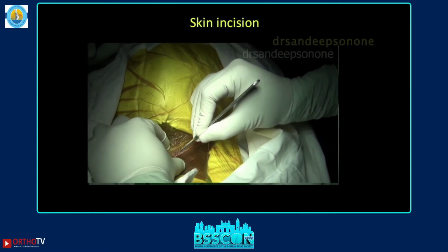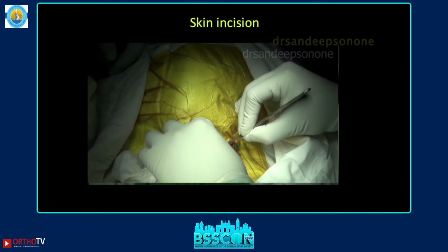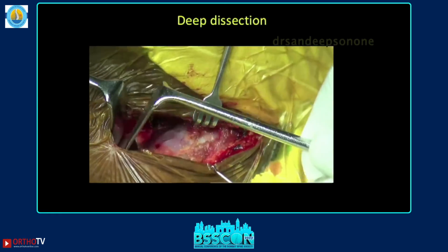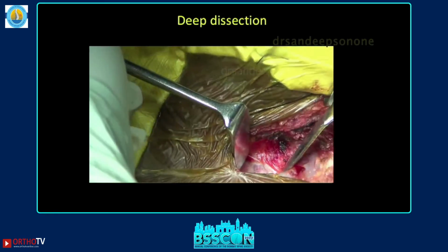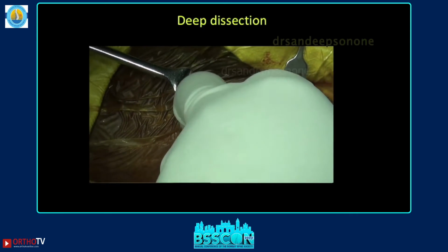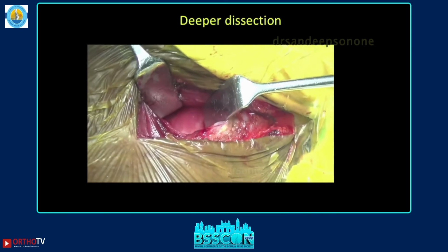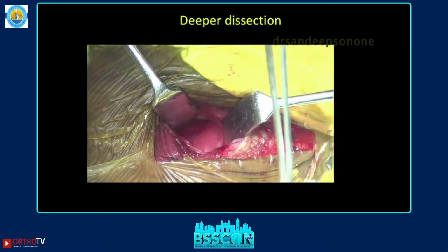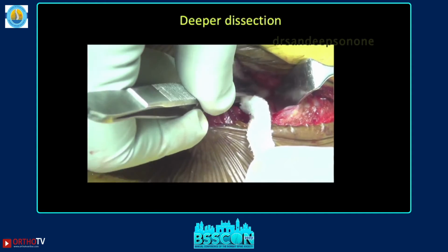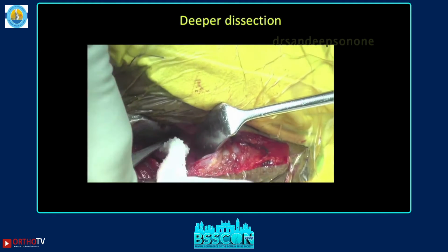Now once you take the incision, I usually start from the distal part of the dissection. So it's pretty much the anterior approach that we use in the subaxial spine, and reach the pre-vertebral fascia through this approach. The proximal dissection is usually done in two stages. First we need to dissect off the deep plane. So I use a roller pack and insert it below the pre-vertebral fascia right up to the C1 arch and confirm it on the C-arm image intraoperatively.